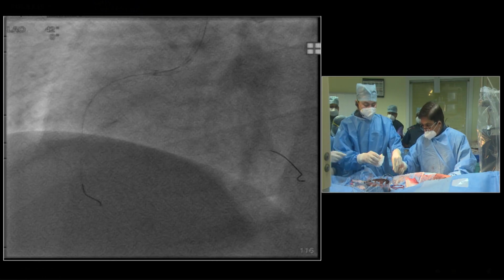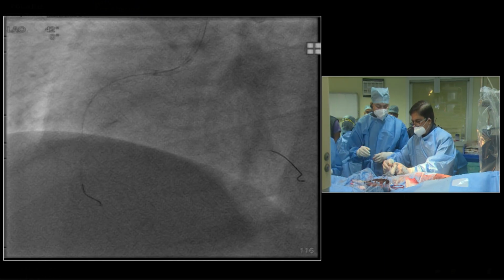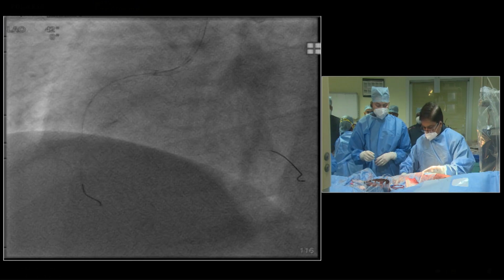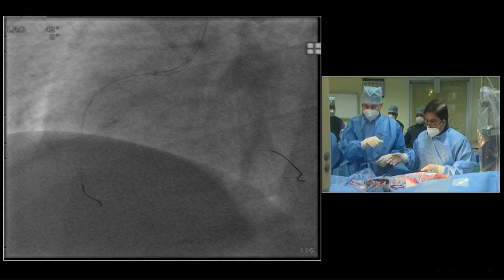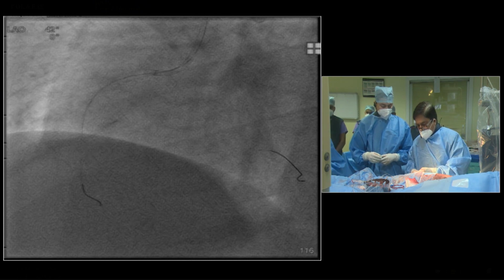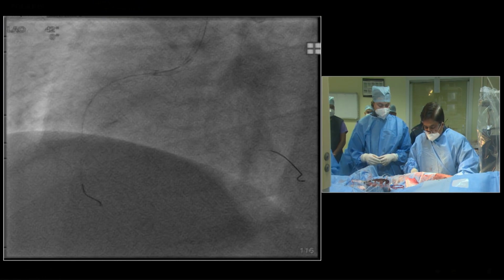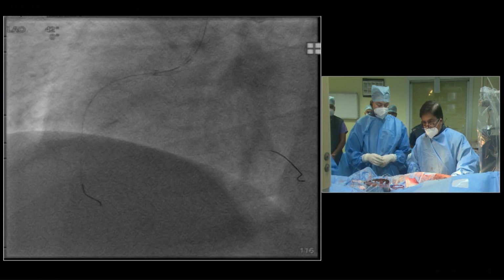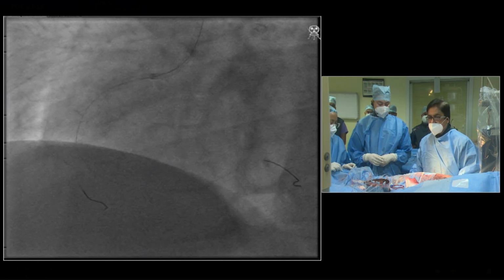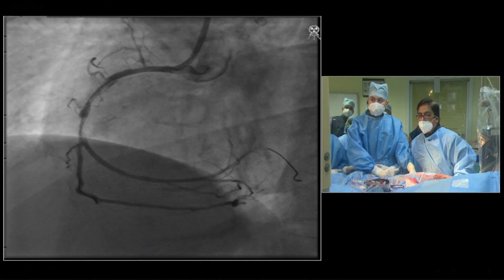Dry gauze. Okay. So again, this is like you've learned in bifurcation, when you're using multiple wires and all these CTO things, you make sure you know how to separate your wires, and especially that your colleague who's there with you also knows the wires. Give me a torquer here, so that I will not be confused. Don't keep both the wires together in one space. You just keep them in 2 different planes. What I do for these 2 wires, I have a principle, but that's my principle. Put a torquer on the main branch wire and a gauze piece on the side branch. I will always remember. Everyone will know it. But our assistant also should know which wire is actually with the torquer. All right, so it is done.